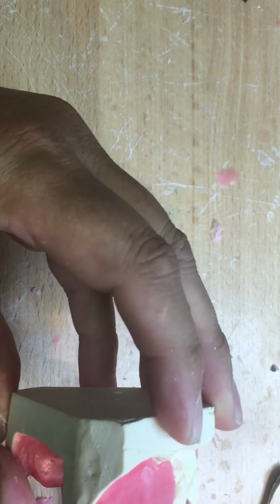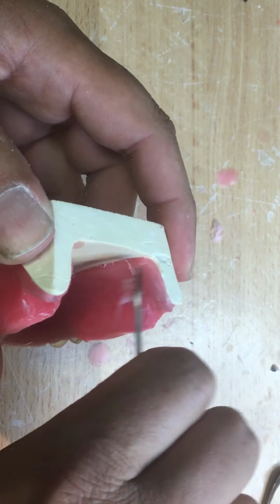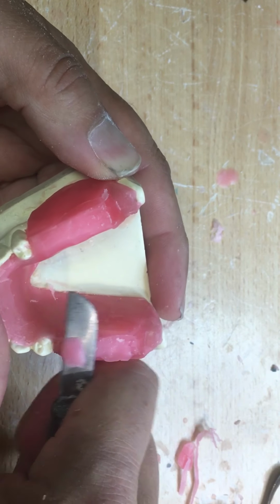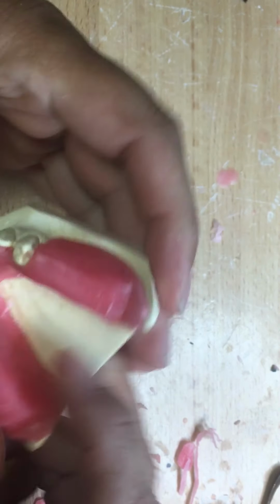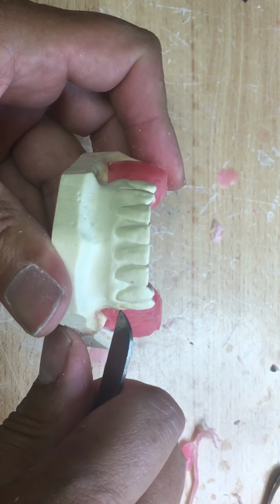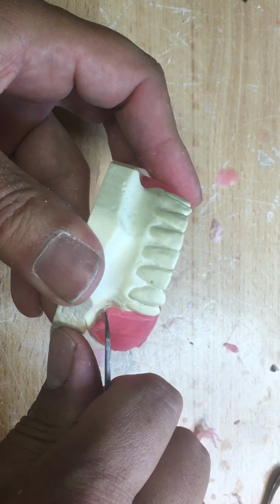And then I think that's the difference between a good day and a bad day. Sometimes things just don't work out, and then we start fresh the next day or the next case. This is still soft, but I'm entertaining you with stories from the bench.